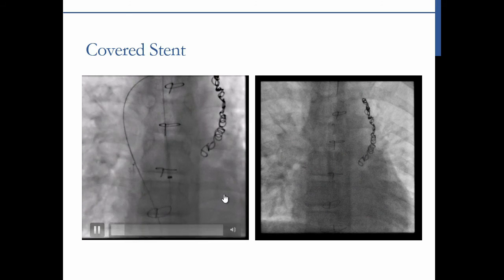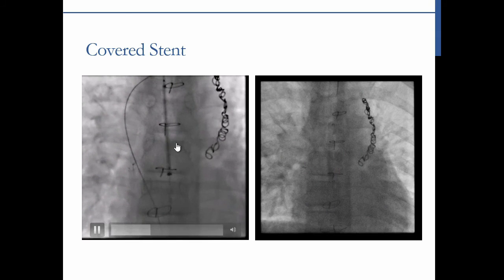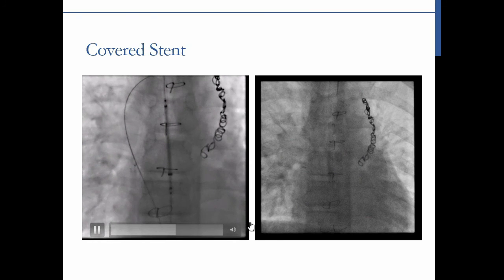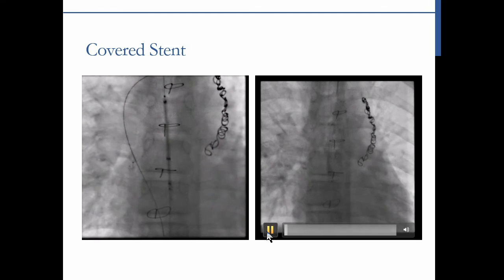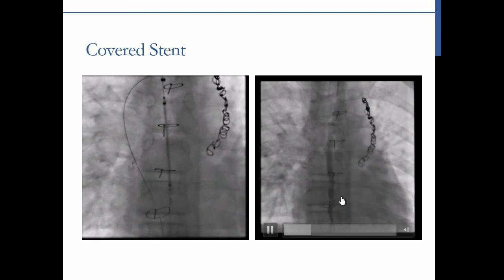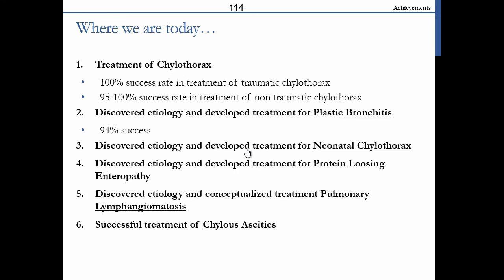So can we do stenting? Yeah, absolutely, and we did. As you can see here, the stent comes. He was big enough. It's the biggest stent we have, 5 millimeter. And here we inject contrast post-stenting, and you can see we completely excluded this area, and he is cured.